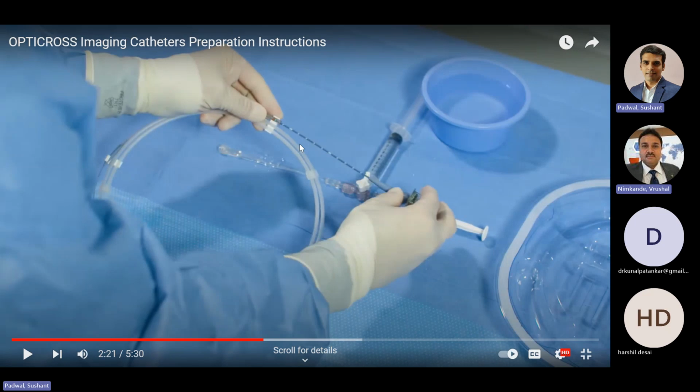But in automatic pullback, the maximum pullback happens only for 100 mm. If you are doing a manual pullback, you need to hold the red marker with your left hand. On the right hand side, the connection will be there on the MDU. This portion will be connected to the MDU. So your right hand will hold the MDU and you will just pull your right hand slowly when imaging is on and manual recording is on.